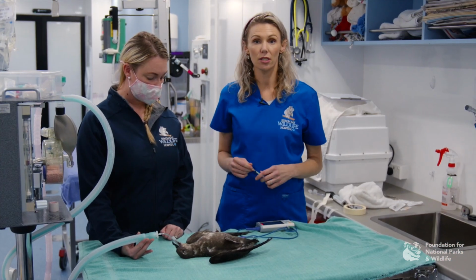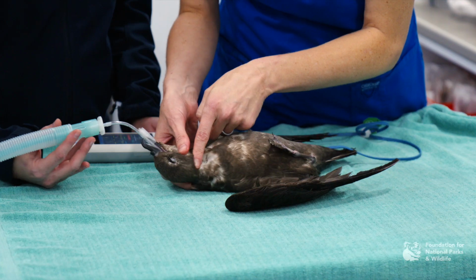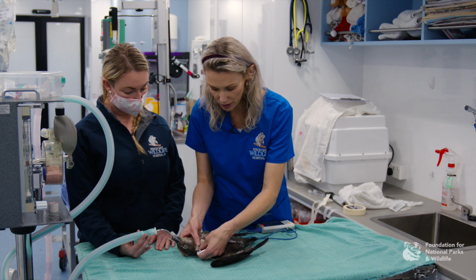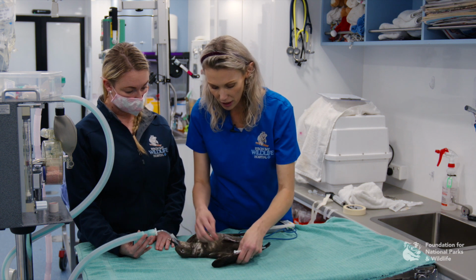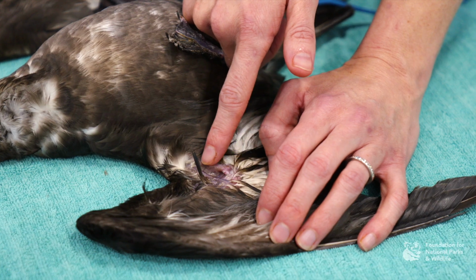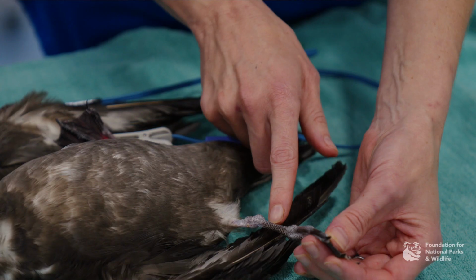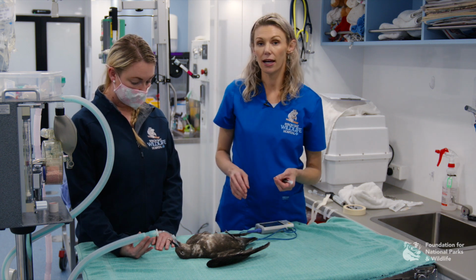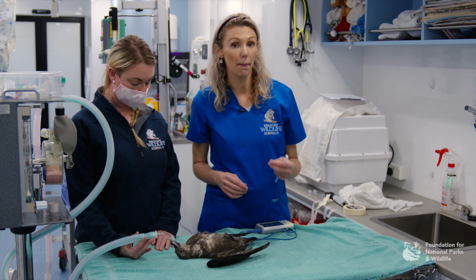Appropriate blood collection sites for birds include our external jugular vein, which doesn't have the featherless tract region, but you can still find it if you part the feathers. You've got your medial wing vein, also known as your cutaneous ulnar vein. You can also use your medial metatarsal vein or your lateral tarsal vein as well, and that's really easy to get in your larger birds like pelicans.